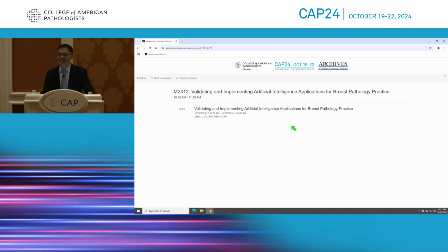That's the recommendation I would make: if you're going to start the system, carefully select what scanners you want to use. It doesn't have to be the same scanner all the time, but with the IMS and management system and AI tools, as you've discovered, I'm sure, working with your IT people at the very beginning of implementation and planning is critical. Yeah, exactly.